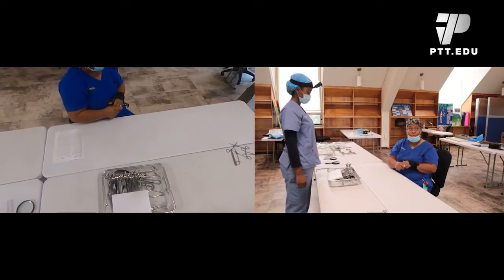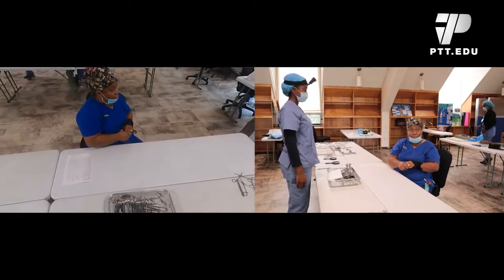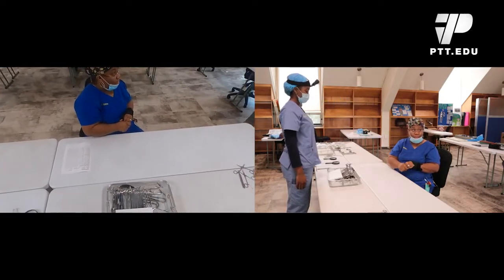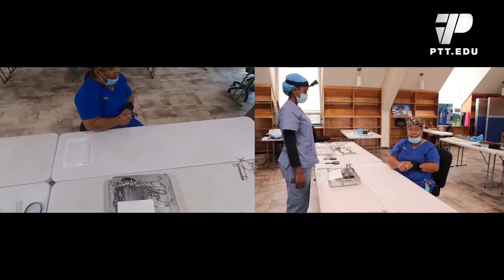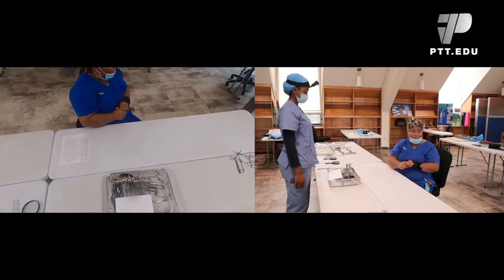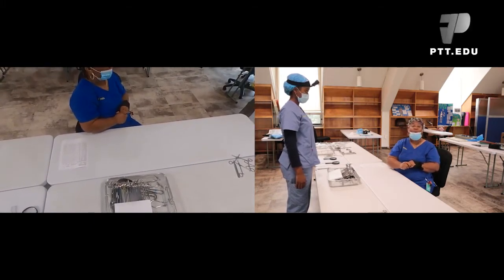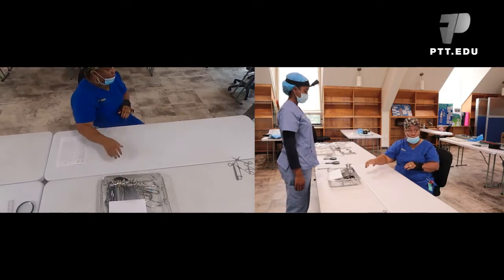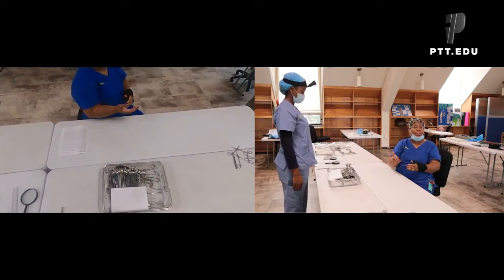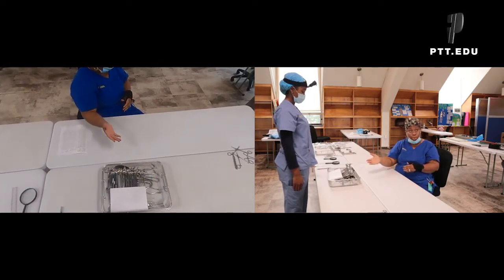And there are sometimes when techs forget to put their internal indicators inside of their trays. If they do not find the internal indicator inside their tray, I don't care how beautifully put together that tray was, I don't care how correct that tray was, this tray will come right back to here. Actually, it'll go straight to here. Because they cannot guarantee sterility. That is an internal indicator.